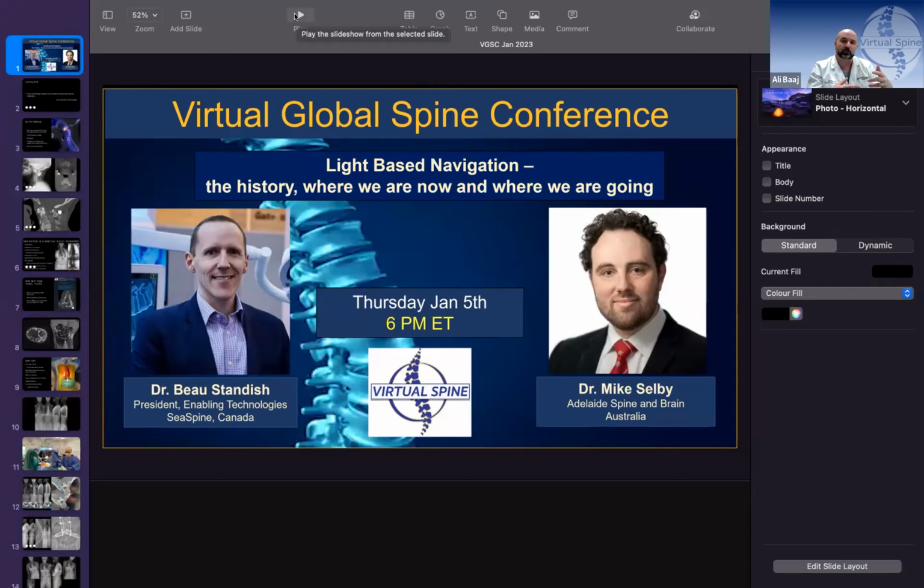Should you need to utilize it for further nav-assisted work, if you will? Let's say you need more fixation or interbody work. How does that technology adapt to changes in the structure of the anatomy in front of you as you do releases and bony work? Yeah, I'm going to talk about that a little bit in my talk, Ali, in terms of you have to plan to retain some bone, and once you've taken all the bone, it becomes hard, basically.